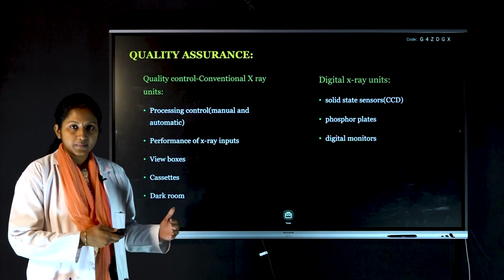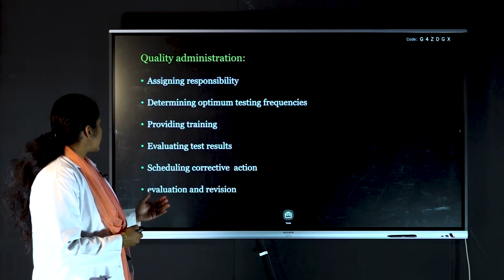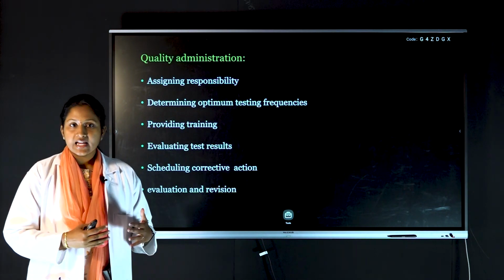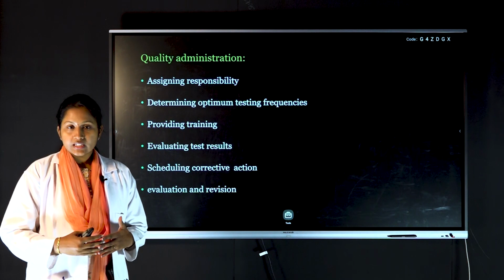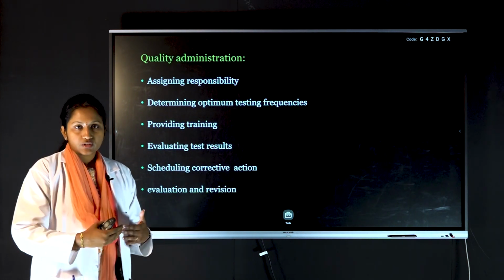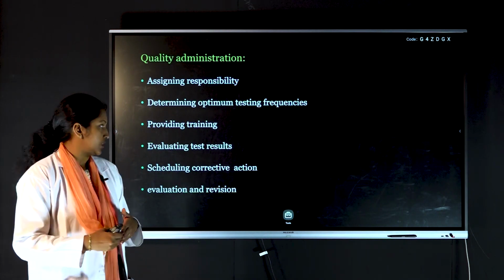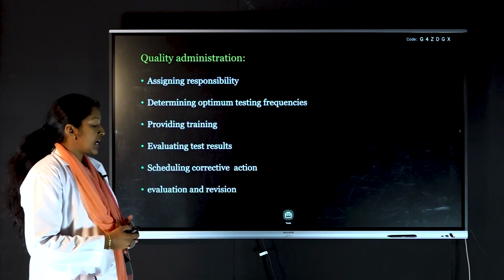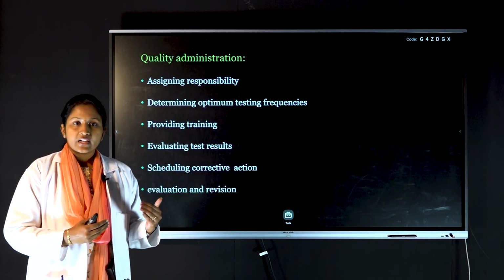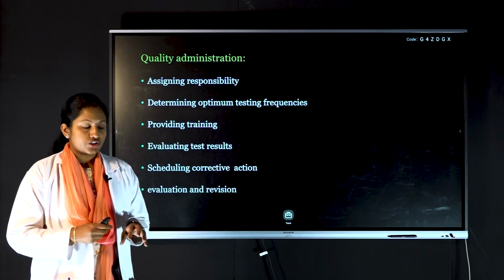As we said, there is something else called quality administration procedures. Quality administration is nothing but assigning the personnel present in radiology different responsibilities, so as to conduct different procedures to ensure the equipment quality and functioning. Those include assigning responsibility to personnel, and also providing proper training to the personnel who perform all these procedures.